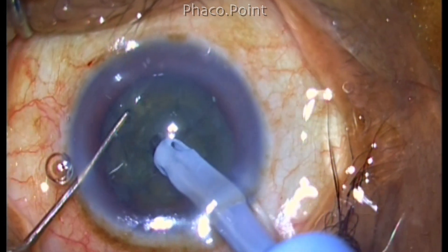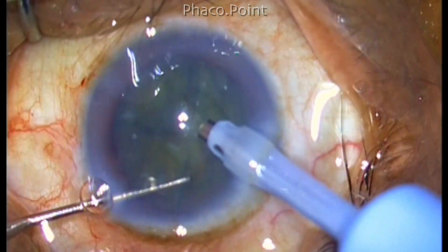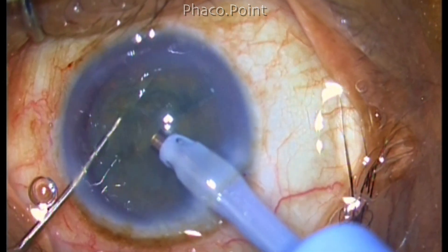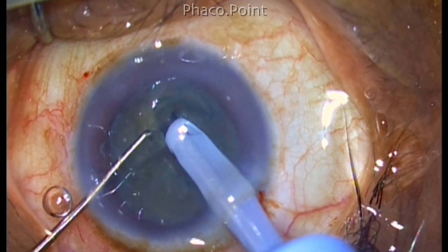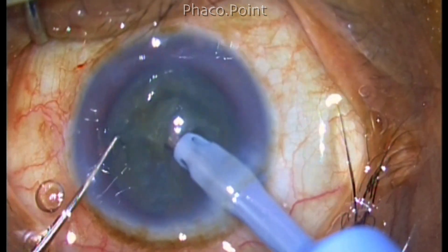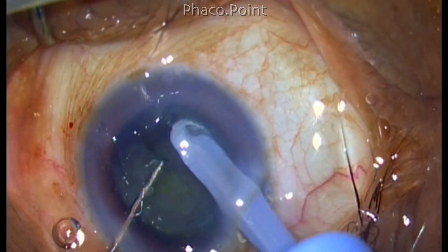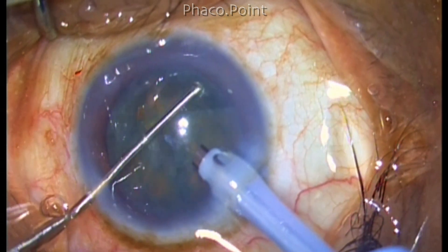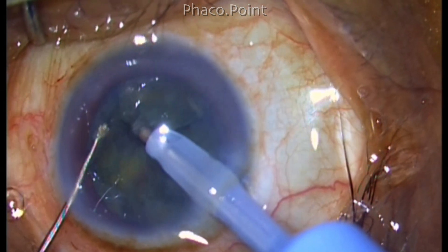However, the nucleus tends to be much softer than I anticipated and there was a little cheese wiring which I encountered while attempting the phacochop. So instead of giving too much power, I gave very little power and primarily holding the nucleus using high vacuum which is around 300 millimeters of mercury. I attempt to chop holding onto the piece with just vacuum. Because the cataract is a little soft, there was a lot of cheese wiring and slowly there was a tendency for a crater to form.